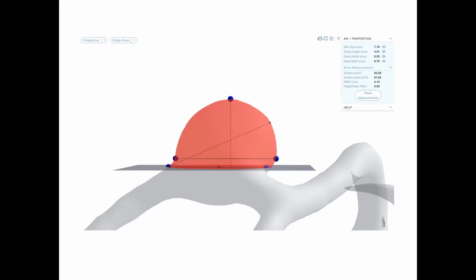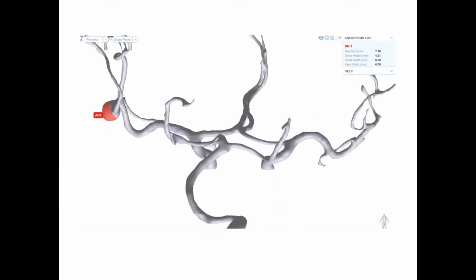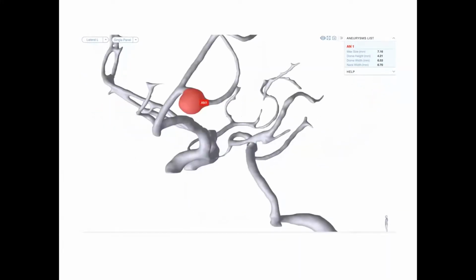The ability to evaluate the neck of the aneurysm, the maximum diameter, the total volume, and quite impressive too that it was able to pick up really more of a fusiform aneurysm. This is really a blowout of that entire segment of that inferior M2 branch, really highlighted best here, and yet the software was able to pick it up quite accurately and sensitively.